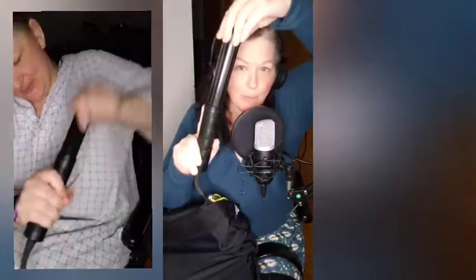The part of the design that's supposed to be accessible, if you can even say that, is that it's supposed to add air to the cushion on both the intake and the outflow. I mean, it's literally supposed to add air both ways. But here's an issue. If you can see this, this is this very small part of this handle that doesn't get absolutely smashed in there. So you're going to have a pinch point here. This is a very tight pinch point.